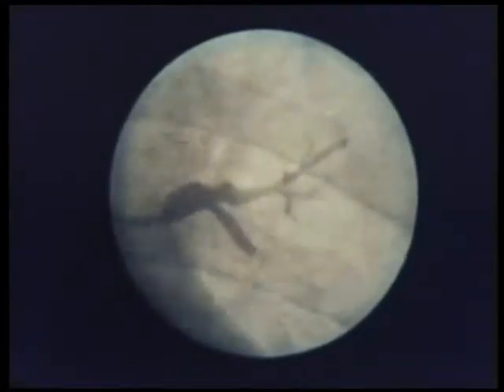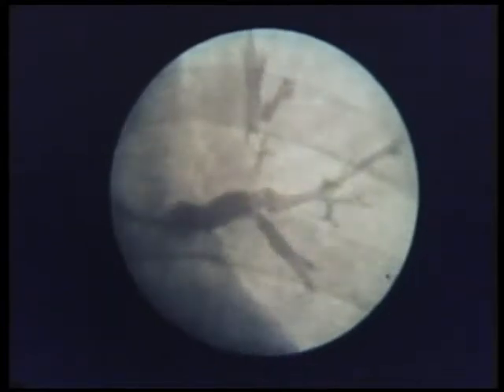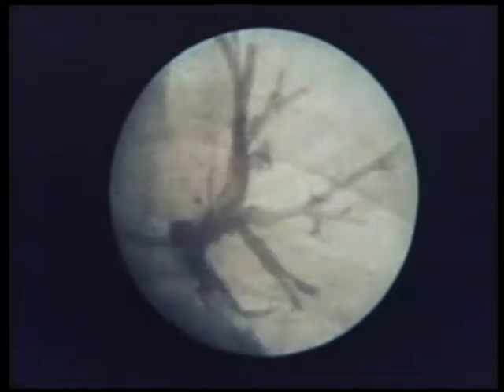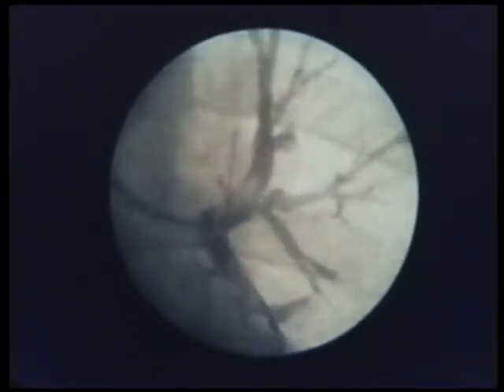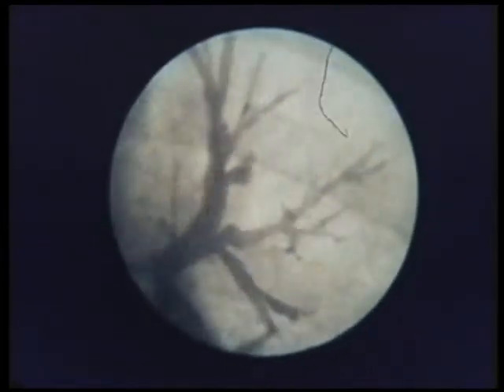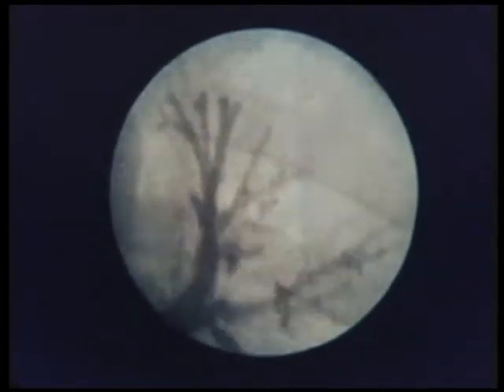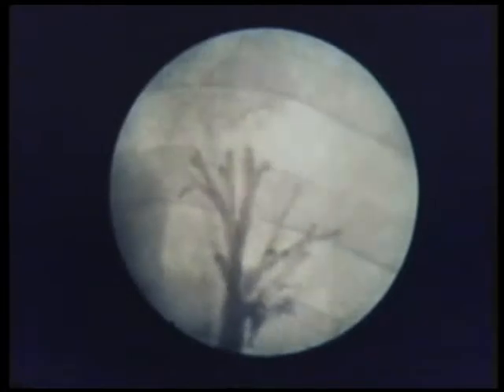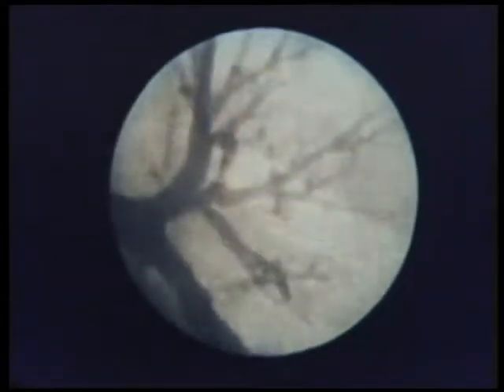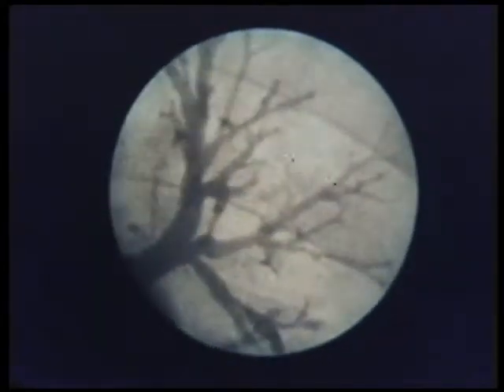After renewing the anesthesia, the water-soluble contrast medium is slowly injected. It first fills the anterior branch, it then flows upwards into the posterior bronchus of the upper lobe. This and its various branches can usually be recognized as far as the periphery. The lingular bronchus arising from the upper lobe bronchus can also be seen running in an inferolateral direction.